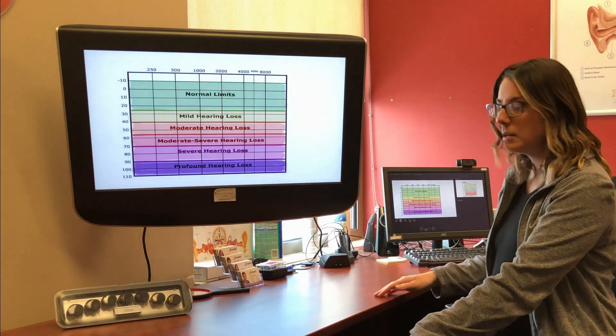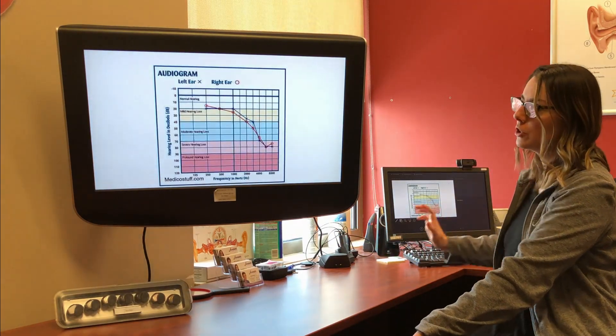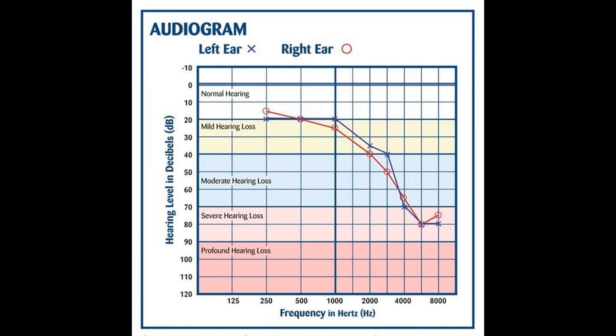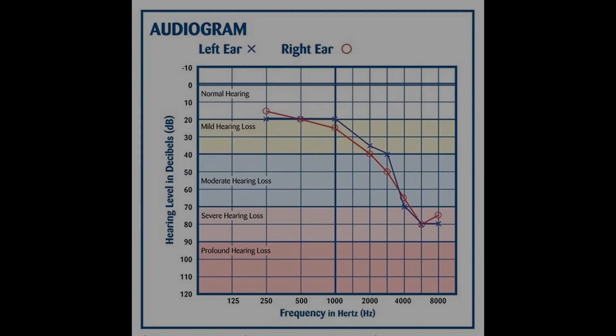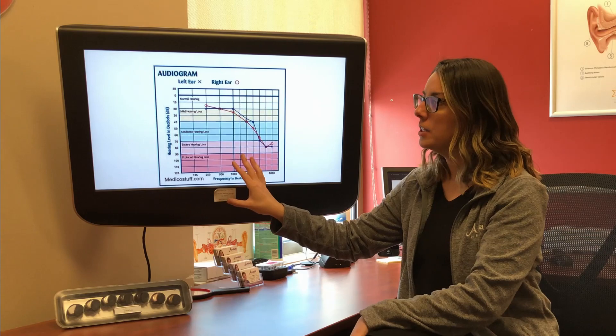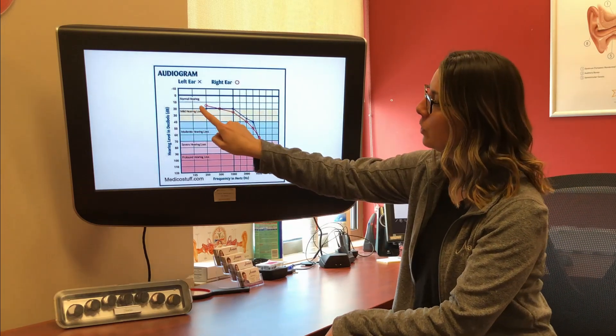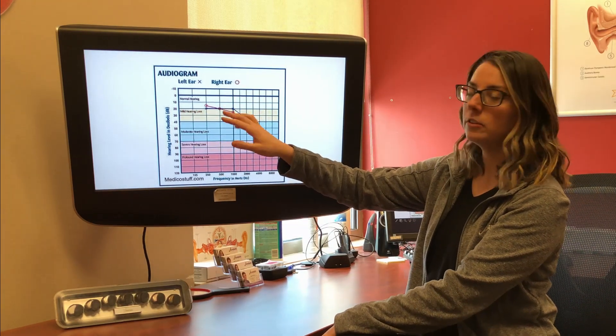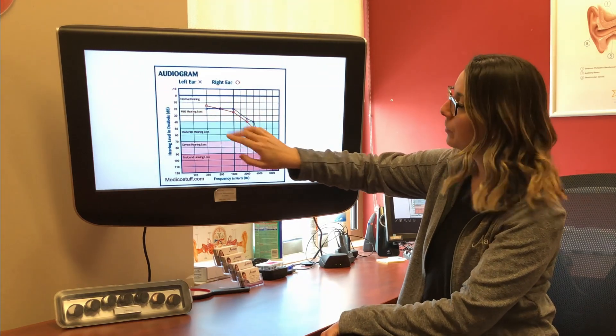So I have an example of an audiogram that I want to show you to make it make a little more sense. As we look up here, we will see the red circles represent your right ear, and the blue X's represent your left ear.